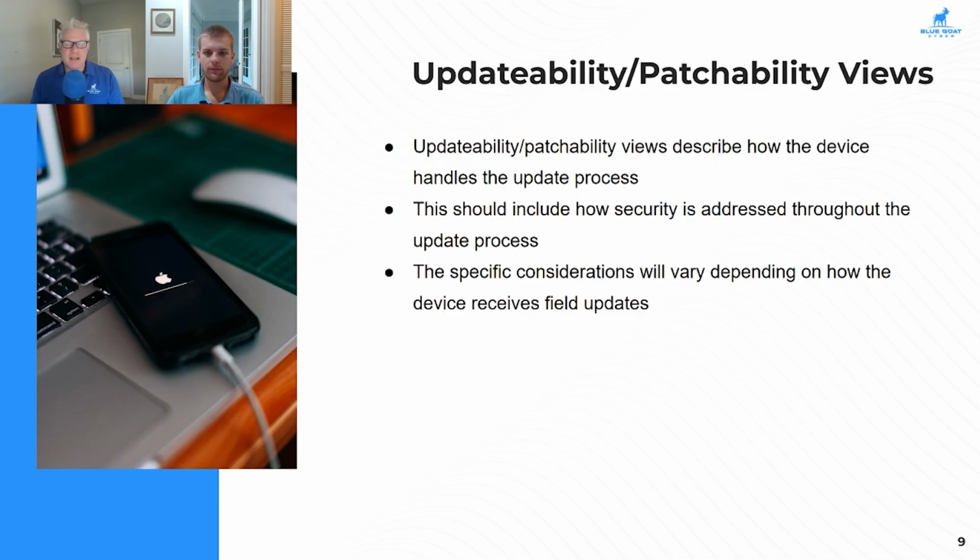Is it safe to say, because this is a question that a lot of clients bring up, that OTA is less secure than having to physically send a field tech to plug a USB device in to do the update? I know you can secure one and not the other, and I'm not providing a lot of context, but in general, what would you say from our experience? In general, there's a little bit more that can go wrong with over-the-air updates, since you have to consider security for that over-the-air infrastructure as well.